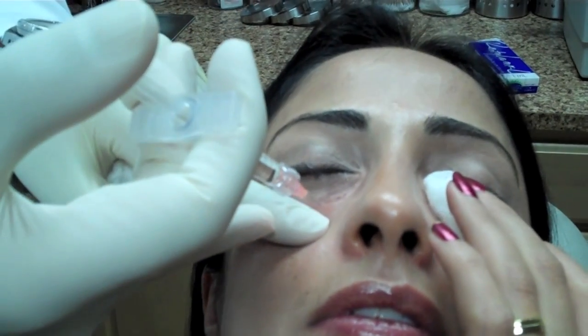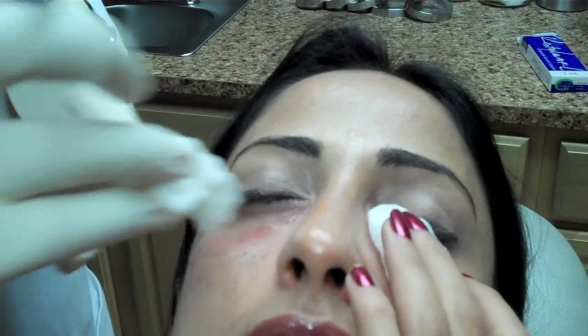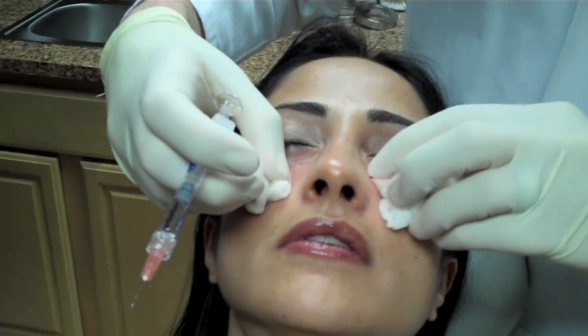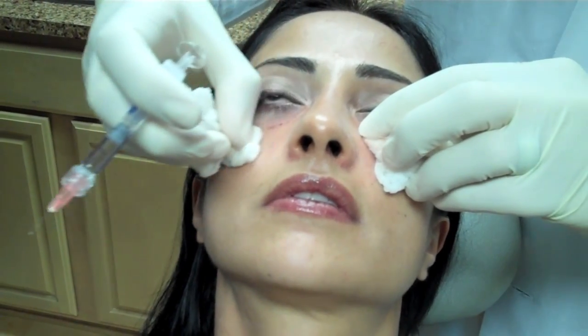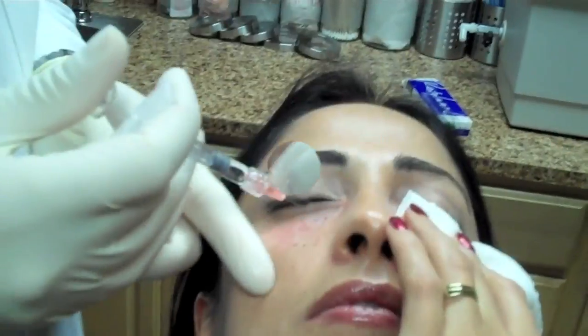It takes a few days to get a really nice contour. Initially, each of these injections will have a little bit of swelling just around where the needle went in. And then over the next few days it gets much better. And you can see the typical bruise that happens on this side. It's a very, very small little punctate purple spots that fade nicely. What I'm going to have you do is I'm going to have her sit up and kind of evaluate it and then retouch it.